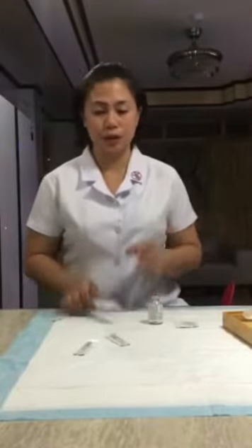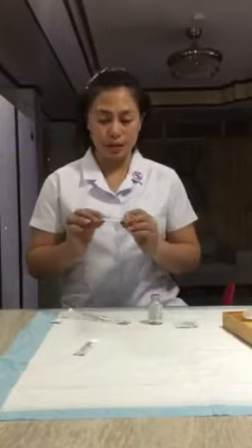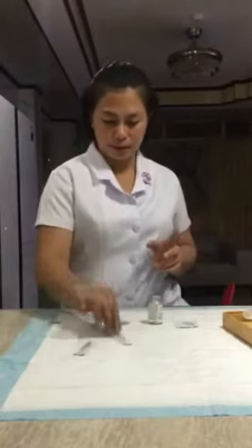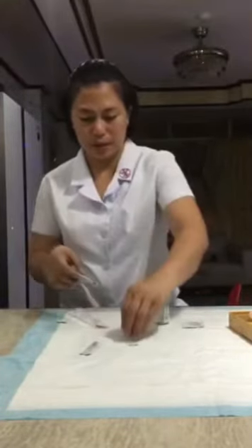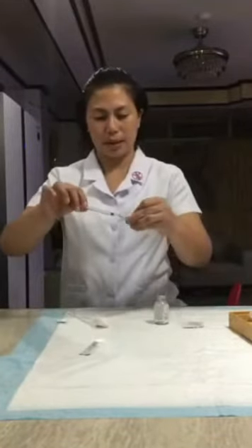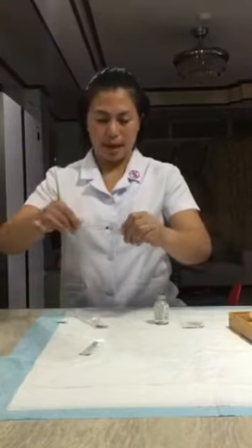Let's attach the filter needle. Since we don't have the filter needle, let's just use the needle here. Agency practice dictates using a filter needle to withdraw pre-mixed liquid medications from multiple vials. The rationale for that is the filter needle prevents any solid particles from being drawn up through the needle. Ensure the needle is firmly attached to the syringe also. Maintain the sterility.